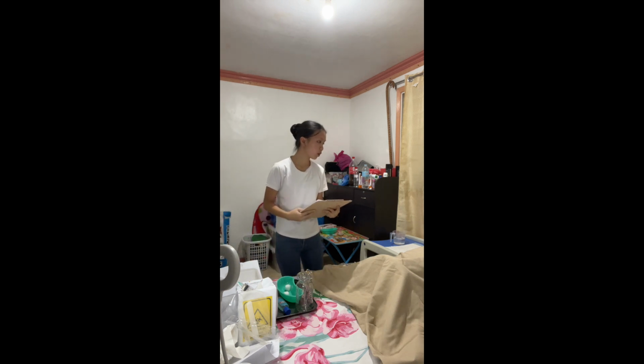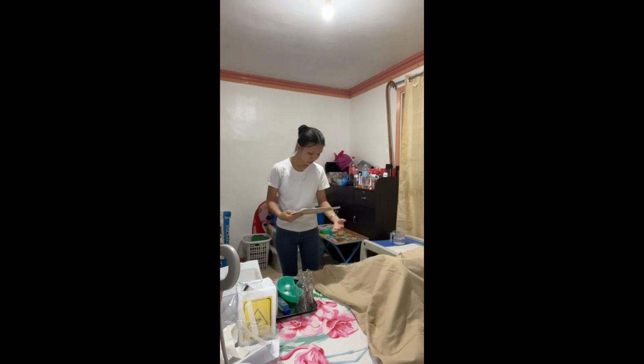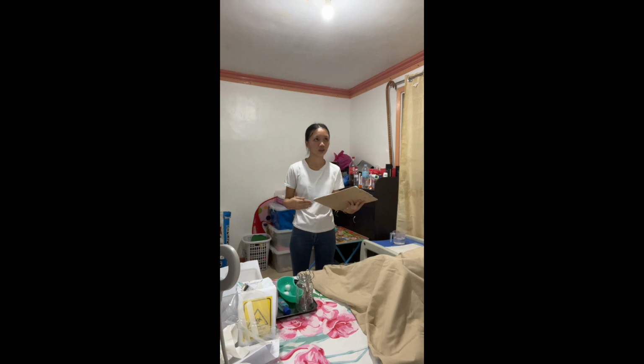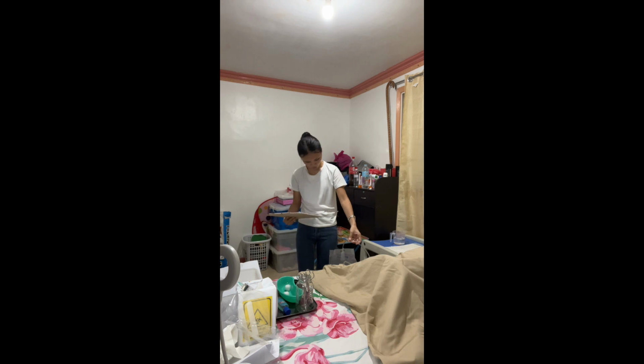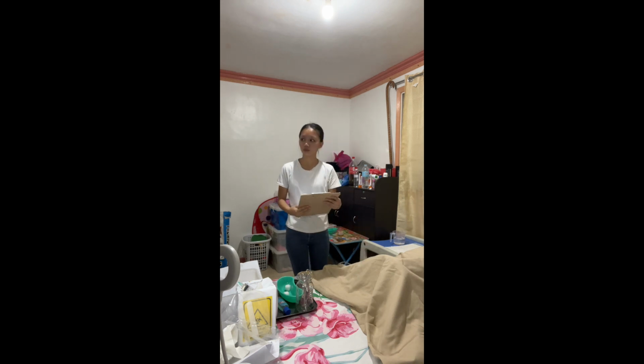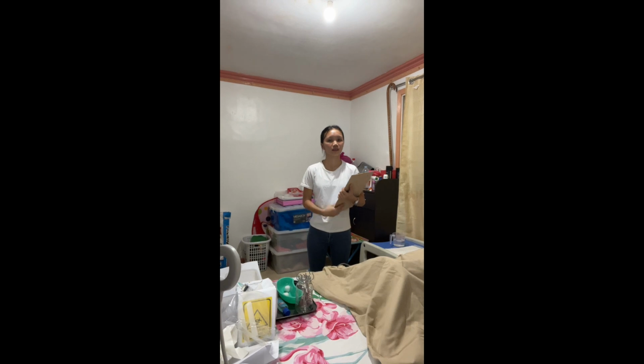Hi ma'am, now I'm going to check your urine output. The normal urine output, or the volume in 24 hours, should be 800 to 2000 milliliters. And the normal color should be pale yellow to deep amber. Okay, so it's good. Now that we are done, we are going to document everything, and that's all. Thank you.